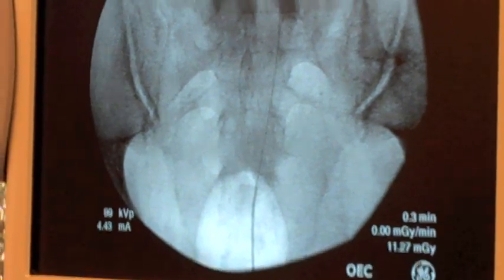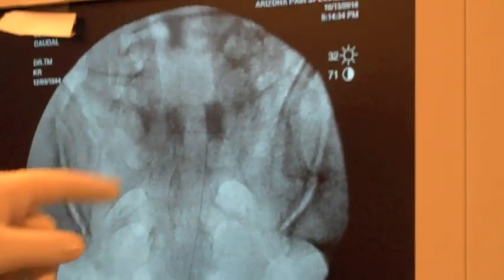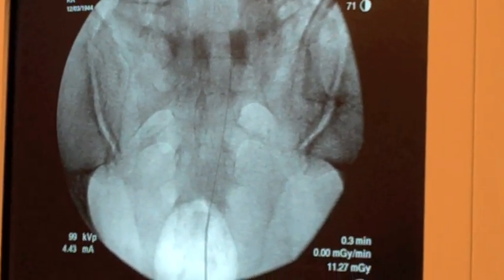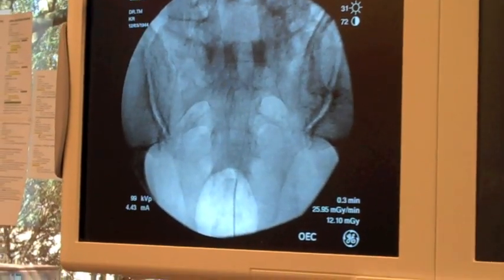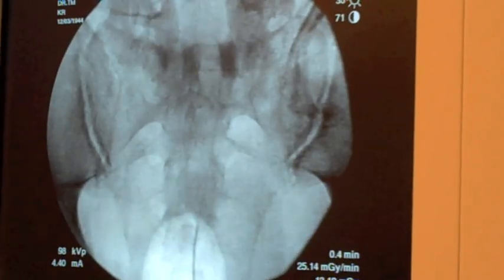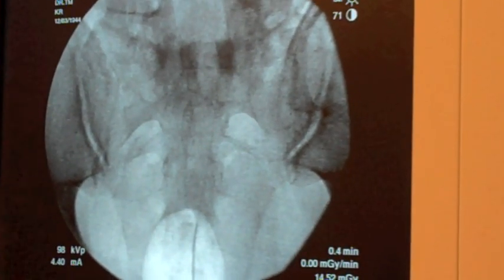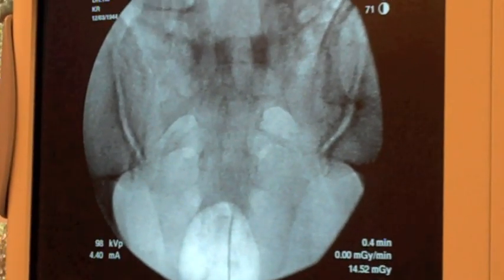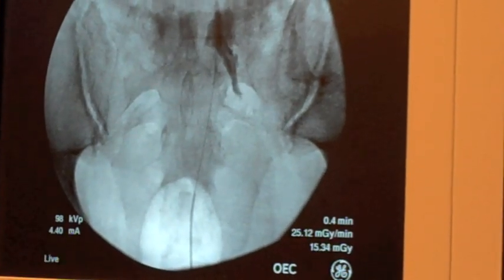You can see there's been previous surgery in this patient with a laminectomy right here, and it looks like a spacer device right here. We're going to steer left, and you're going to see some contrast coming out on the screen.